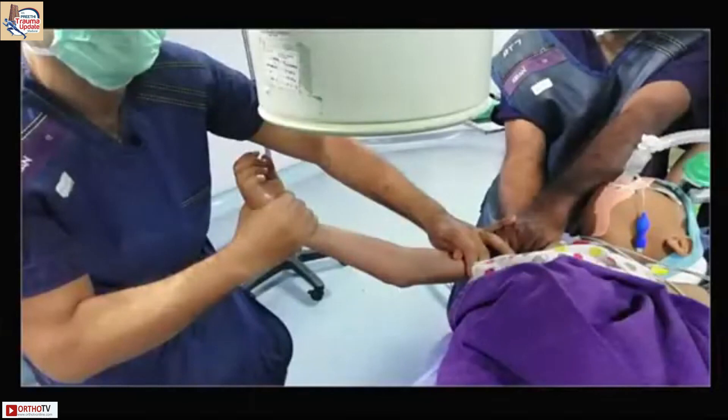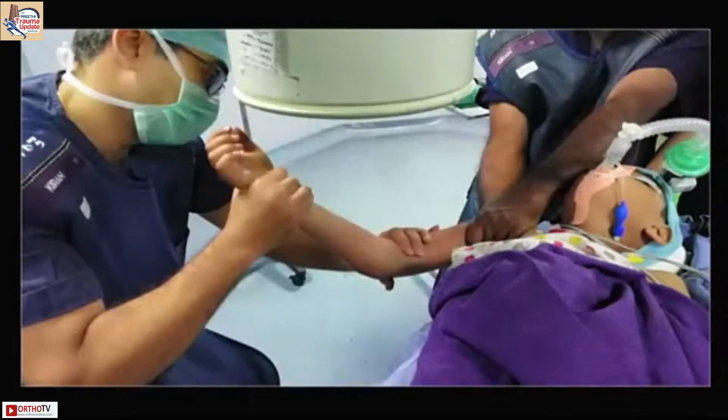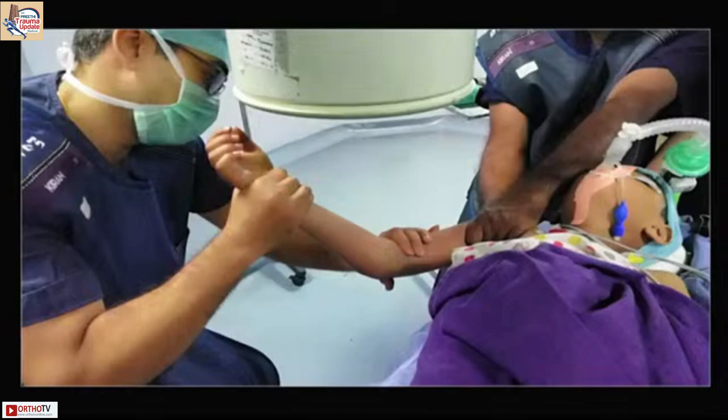Start flexing the elbow and you can put pressure over the olecranon so that you also get sagittal plane correction. And that is the shoot-through view which we see.